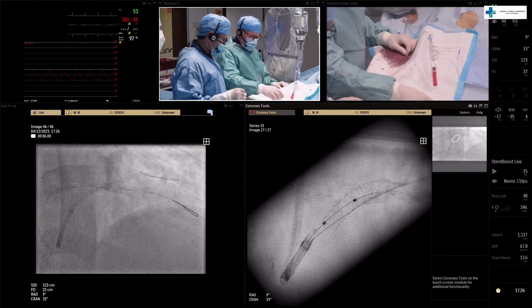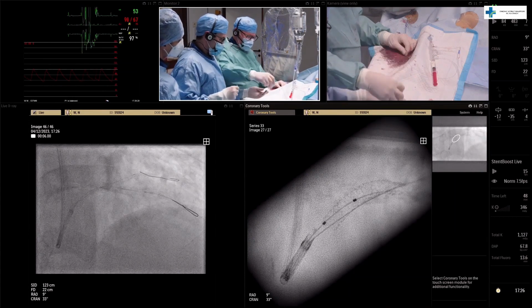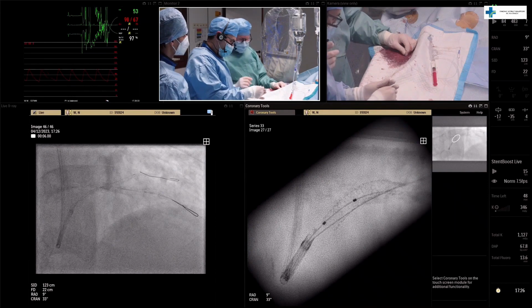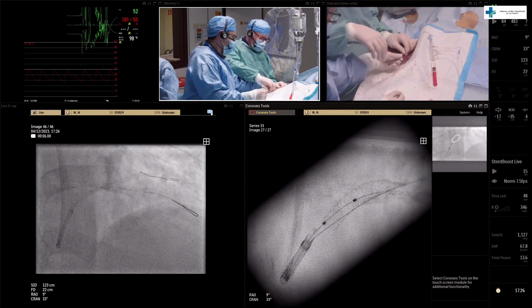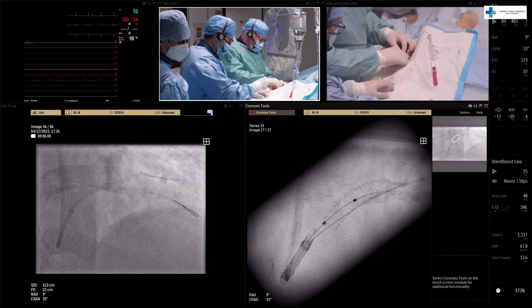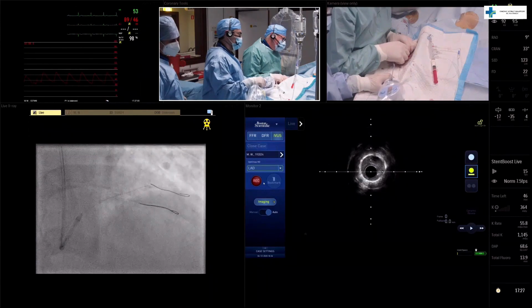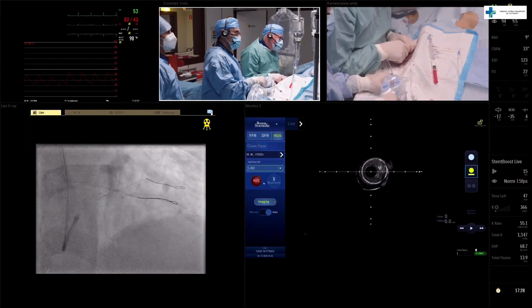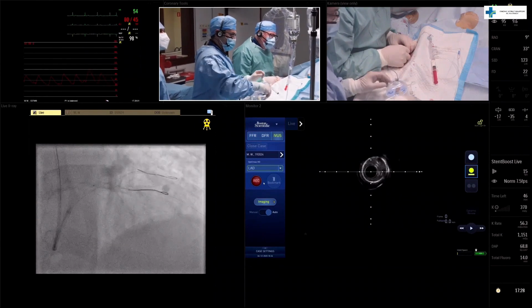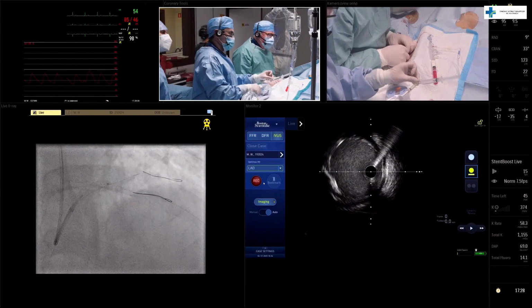However, it doesn't mean that all the time if we go with the loop, we are within the stent, because you can go with the loop through the stent struts and go abluminal. So this is why the next step, as I said before, is to do IVUS. So I have my probe on the wire, and we'll see it goes easily. So let's have a look, Pavel. And we are in the guiding, and then immediately in the stent, which is protruding, but not too much.